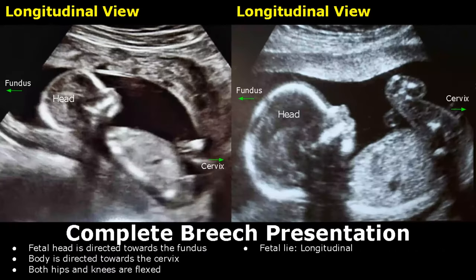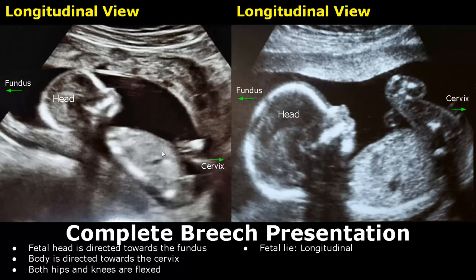We move on to breech presentation, in which the fetal head is directed towards the fundus and the fetal body and legs are directed towards the cervix. If this presentation is seen near the end of pregnancy, a C-section is preferred for delivery. Breech presentation has a few types. The first one is complete breech presentation, where both the hips and knees are flexed. We see folded legs and flexed hips directed towards the cervix. The fetal lie is longitudinal — in a longitudinal view of the uterus, the fetus is also in a longitudinal orientation.